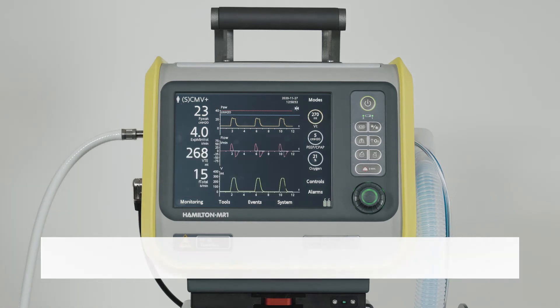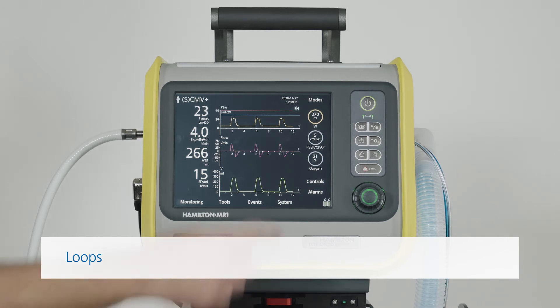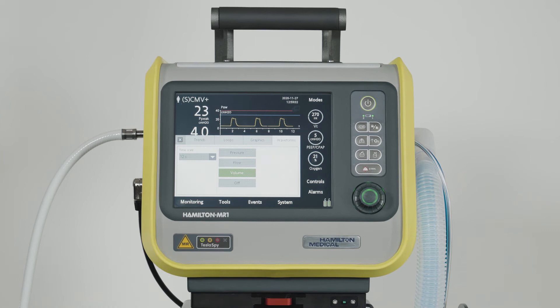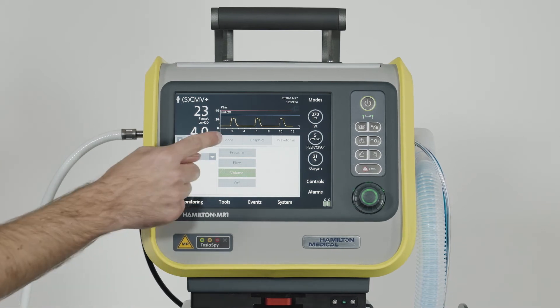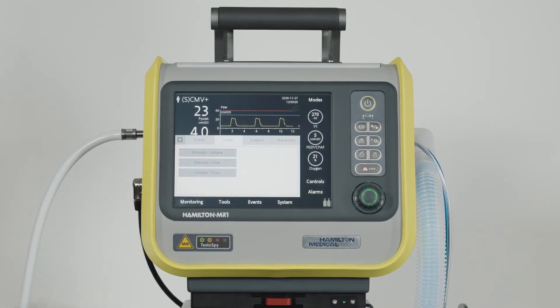Sometimes it's more useful to plot one variable against another one as an X-Y, or loop display. To display loops, touch anywhere in the graphic area, then touch the Loops tab, and select one of the parameter combinations available.